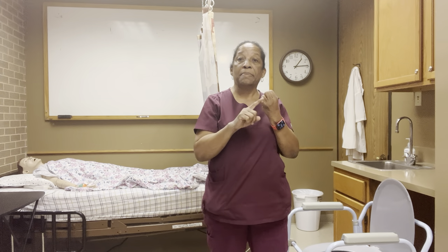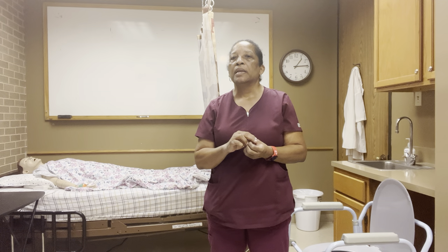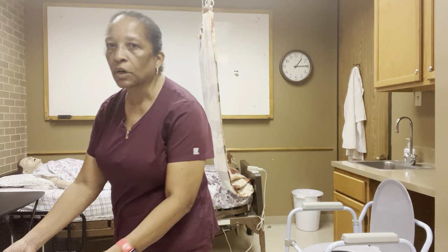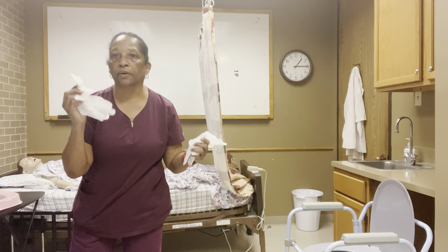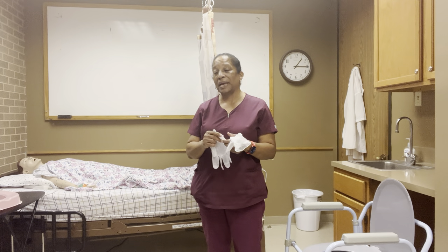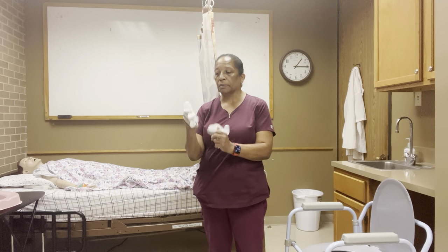For your supplies, you would need a bedpan, toilet tissue, wipes, and four gloves. Now, Pearson VUE — whose credential — does not count off with the client if you don't put a towel or something on the table. That's not one of the checkpoints listed with Pearson VUE or Credentia. So I have my bedpan, my wipes, and my toilet tissue, and two pairs of gloves. Now, I must have on gloves before I go to put the bedpan under the patient — that's the guidelines. You must put on gloves before you put the bedpan under the patient. So I'm going to go ahead and put my gloves on now.